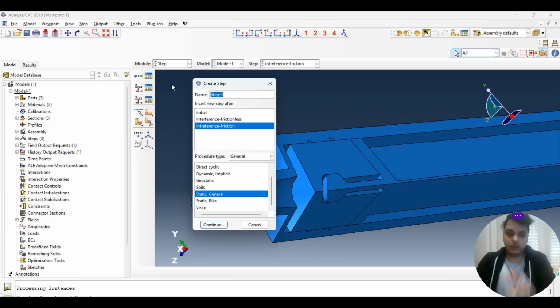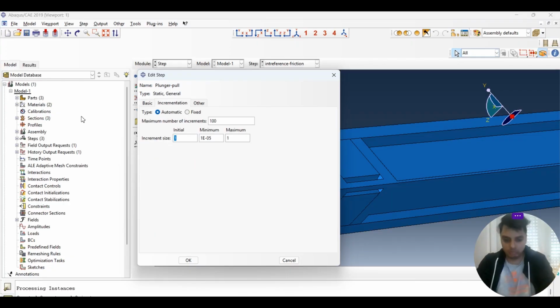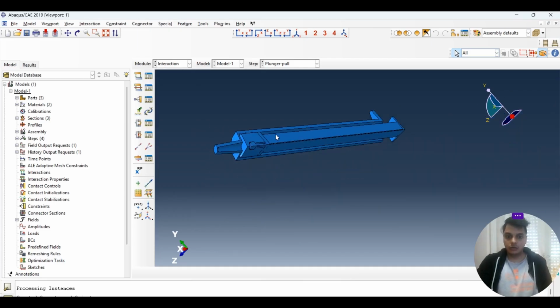And the last step that we want is the plunger pull, where we are going to pull the plunger out, and that's going to be again nonlinear, and we want it to be at a really small increment so that convergence issues do not come into action. It's all fine. Now we have defined all the steps, so now it's time to define the interaction. Again, the interaction is simply like how you define the material properties. You remember, initially we defined the material properties, then we assigned those properties to the part. Exactly the same we do for this.